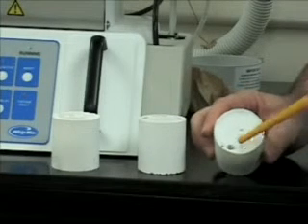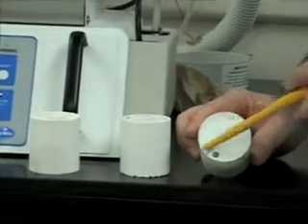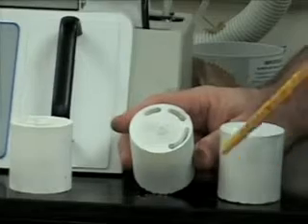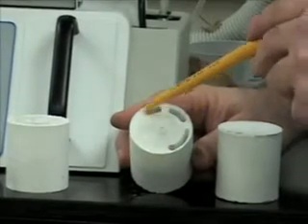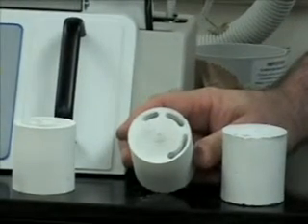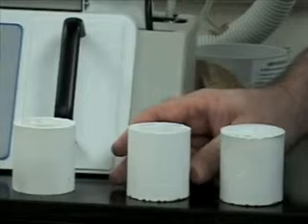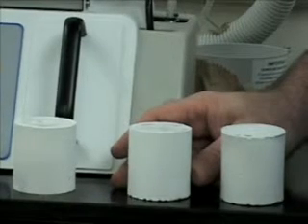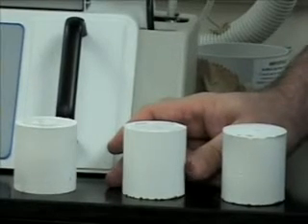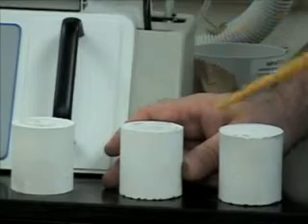I have a mold here that has just a single hole basically drilled into it and nothing else evident in the mold. And then I have a second mold here that has some slots, and they're interspersed by no cutting action whatsoever. So it's kind of a skip or a dashed line, if you will. It's important to understand if the spindle was moving. So if you get this type of artifact, the first thing you probably want to do is reinitiate another cycle just briefly to ensure that the spindle is turning.